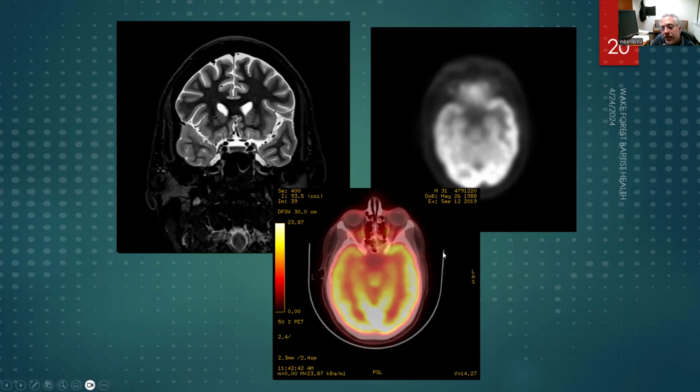And then these 2 images are related to FDG PET, where you give a person glucose. So this is a color map of glucose metabolism in the brain. It's color coded with low levels of metabolic activity in black and high in white. I don't know if you guys will appreciate this, but it's slightly yellower and less bright white in the right temporal lobe. And these are flipped. We always look at the patient's perspective. So I'm pointing to the left side of the image as I say right temporal lobe. But this is a little bit less white than this side. It's pretty white back here on both sides, but as you come up to the anterior temporal lobes, it's not as white. So the right temporal lobe's metabolic activity is sitting about here. The left is sitting a bit higher, kind of up here.